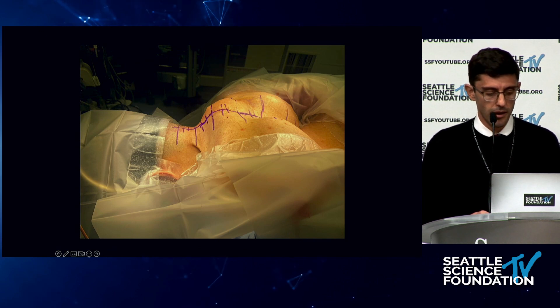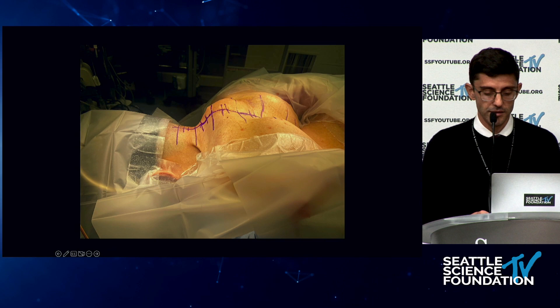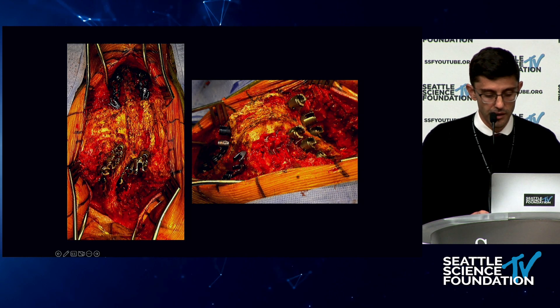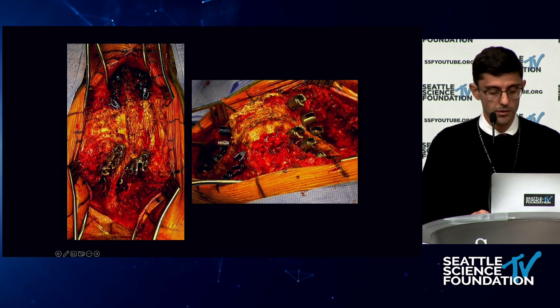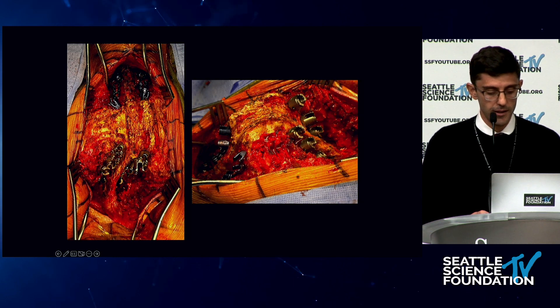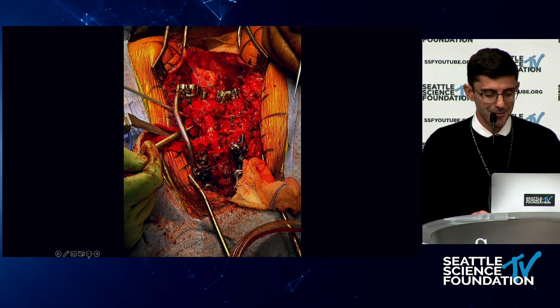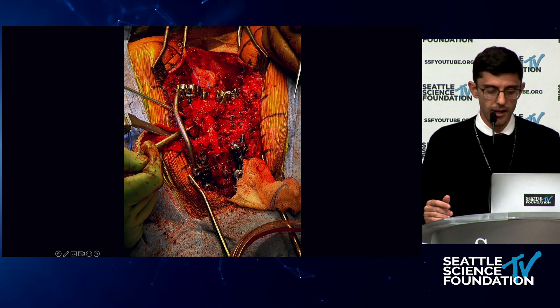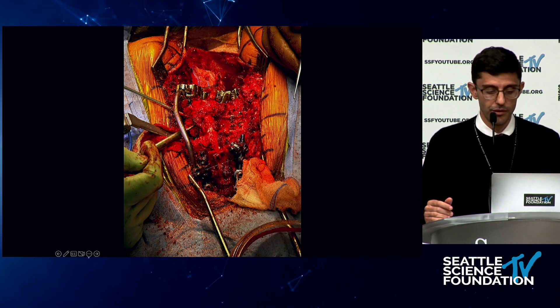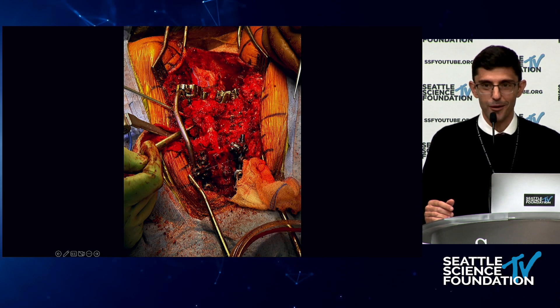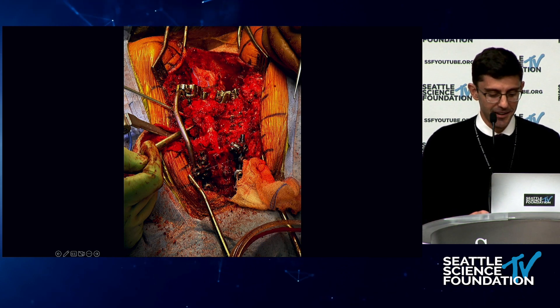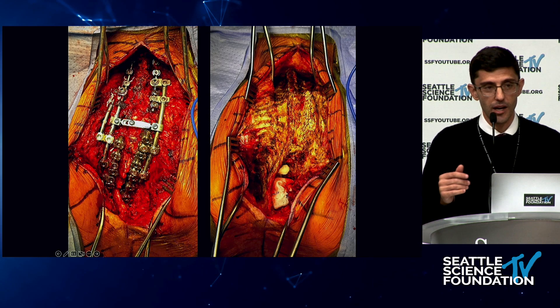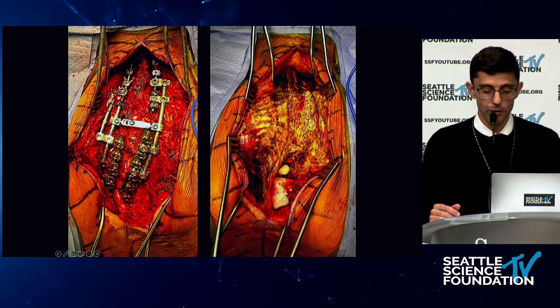A very small girl with prominent thoracic spine deformity. We broke the procedure into steps using the rail technique, going from C2 down to T10, placing instrumentation in the proximal cervical spine and distally. The accessory rod — the rail — provided temporary stabilization while working underneath it to remove the vertebral body. We lost motor signals during the decompression, but by the time we were able to shorten and correct her, everything returned to baseline.